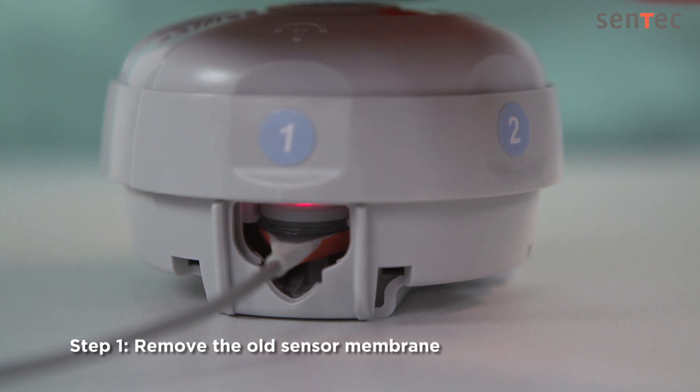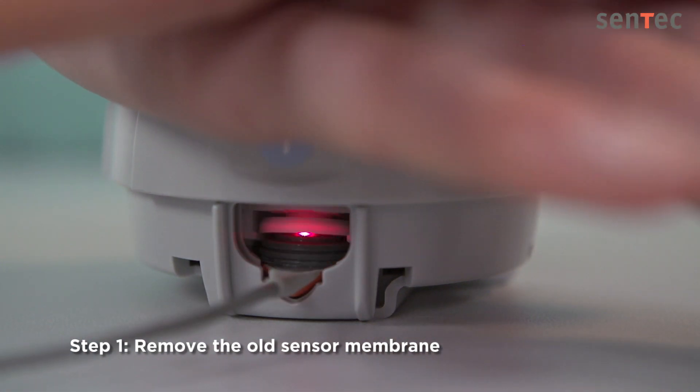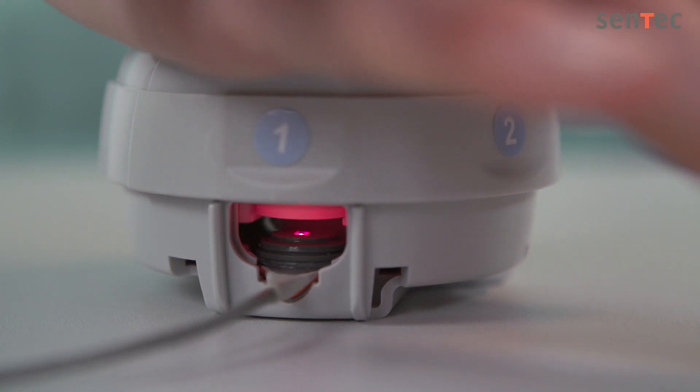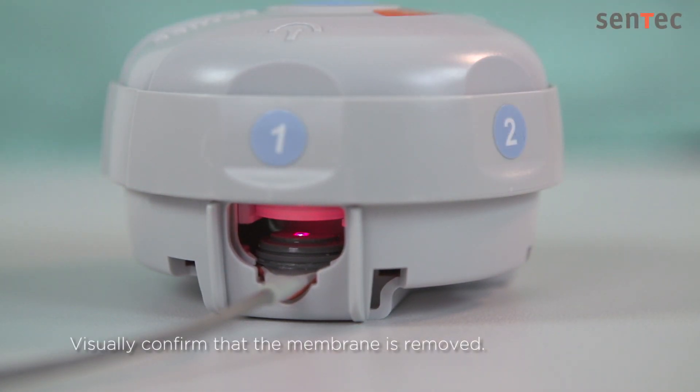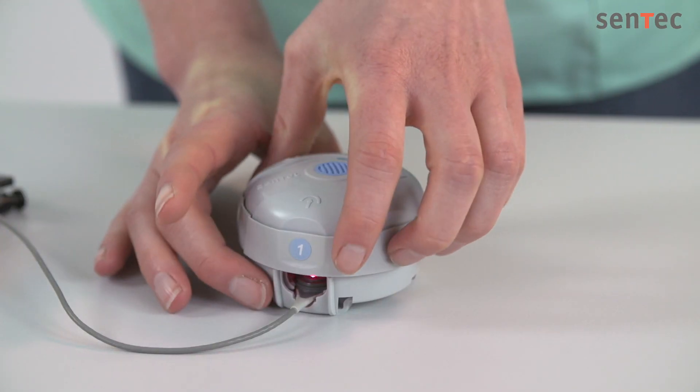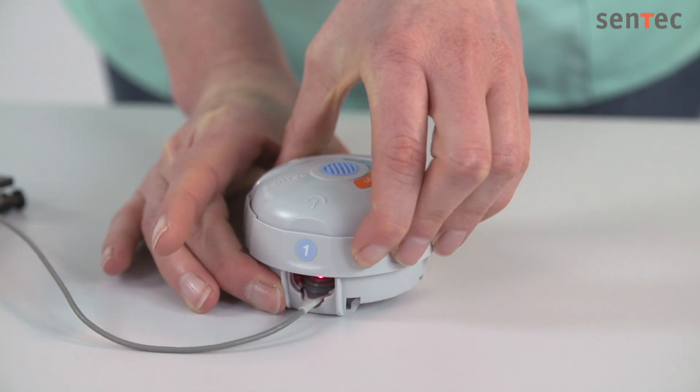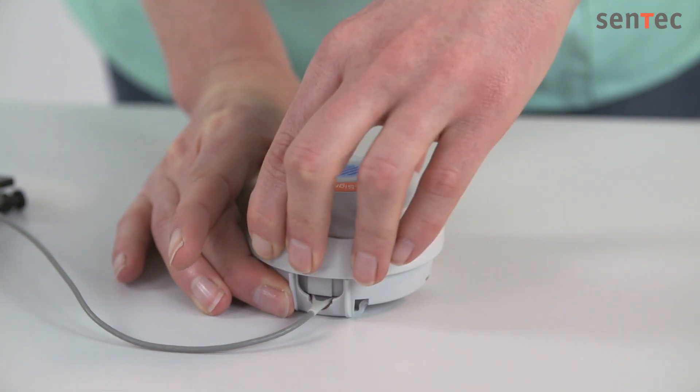Step 1: Press down slowly but firmly. Hold for three seconds before slowly releasing. This removes the old membrane. Visually confirm that the membrane is removed. Hold on to the lower part of the membrane changer with one hand, and with your other hand, turn the part with the numbers one click clockwise to the next step. Keep the membrane changer horizontal and on the table.